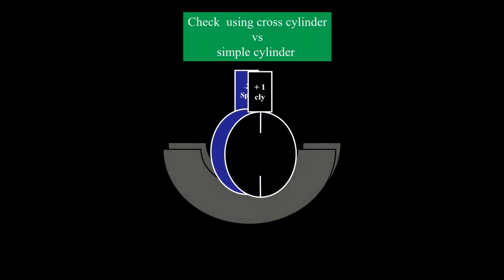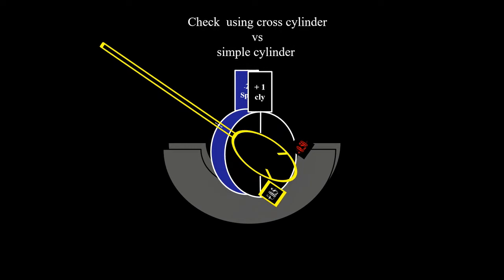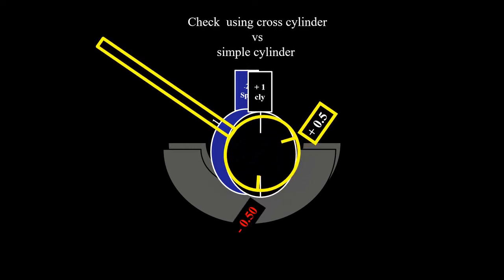Now, what is the value of using the cross cylinder? Why don't we just use any cylinder from the trial case and ask the patient? When we are using a cross cylinder, the cross cylinder affects the two meridia, the one we are testing and the one at 90 degrees.